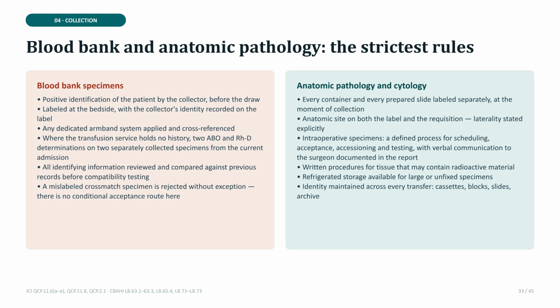If delays are inevitable, follow the specific refrigeration or medium requirements for the sample type. Adverse reactions to phlebotomy must be a standalone component of your training and competence assessment. Whether it is hematoma, syncope, or nerve injury, your staff must be prepared to act instantly. Always release the tourniquet before withdrawing the needle for a hematoma to minimize tissue trauma.